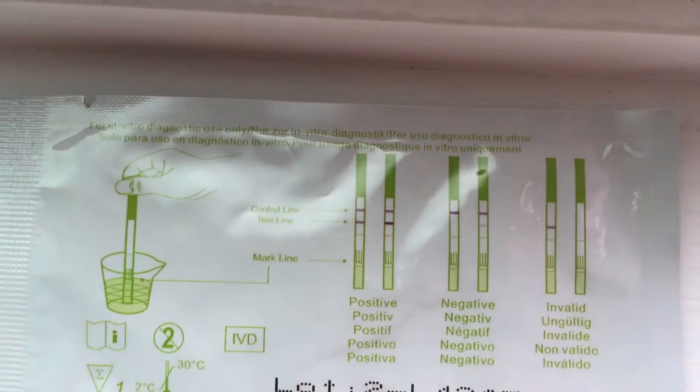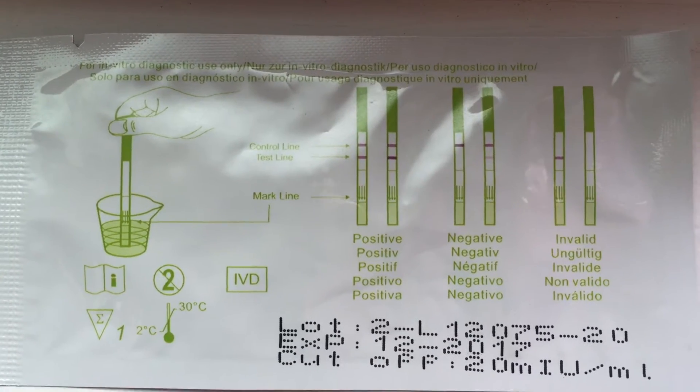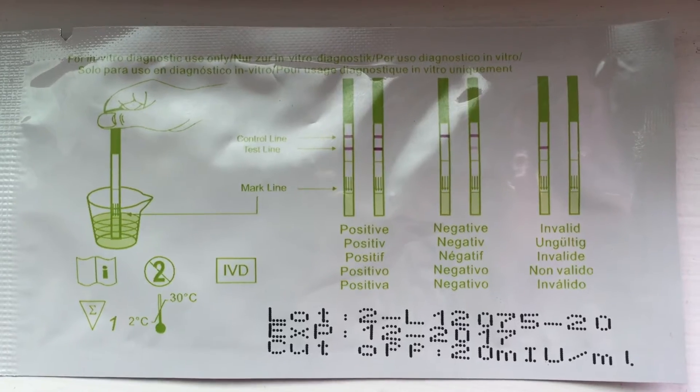So let me just show you guys what I'm talking about. Here are the little strips that I buy from eBay. I think there's like a pack of $15 for like only $4, guys. So don't spend your money on super expensive stuff unless you want to.